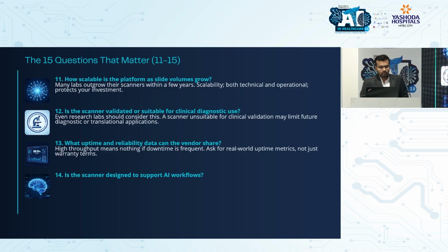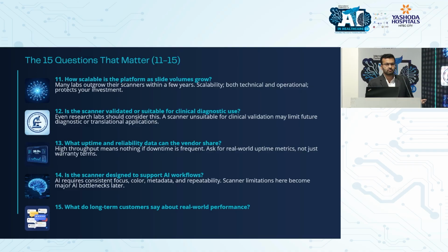Is the scanner designed to support AI algorithm and AI workflow? So you need to discuss with your software provider if AI algorithms can be integrated into your routine workflow, or how easy is it for that to happen. So they should be willing to help you with all that. Right, because the scanner is there, the software is theirs. They need to open the code, or they need to push data from there into your AI pipeline. So you need to figure out if they're willing to do that. Big companies, you know the hierarchy. Smaller companies, it's easier. But then technical support of bigger companies, smaller, you need to weigh all those factors in. And then obviously find out from the customers, like how is the scanner, what is the support like, what is the breakdown time, right? So this was all about the scanner.